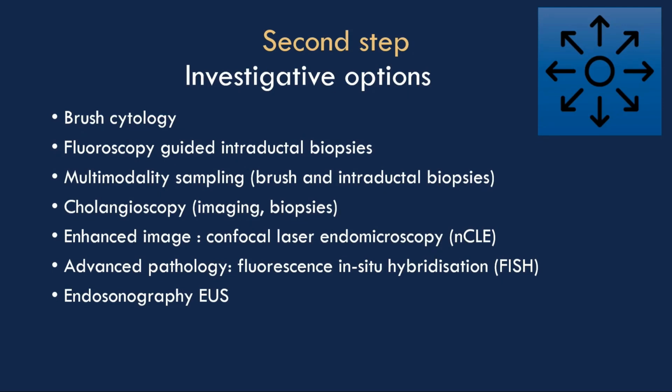So if you don't have any diagnosis, you have to move on, and you can perform invasive imaging. During this invasive imaging, you can perform brush cytology, fluoroscopy-guided intraductal biopsy, or you can mix them. You can perform cholangioscopy or enhanced imaging, advanced pathology, and do not forget that you can perform EUS.